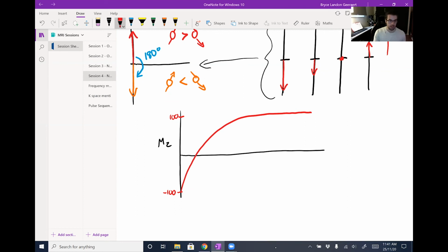But this, again, because T1 times vary by tissue, is dependent upon the tissue that you're looking at. So if this is, say, gray matter in the brain, it's slightly fatty, it has a decent recovery curve, whereas white matter might recover from negative 100 to 100 even faster, probably more pronounced than that, but I'm working with the space I've given myself.